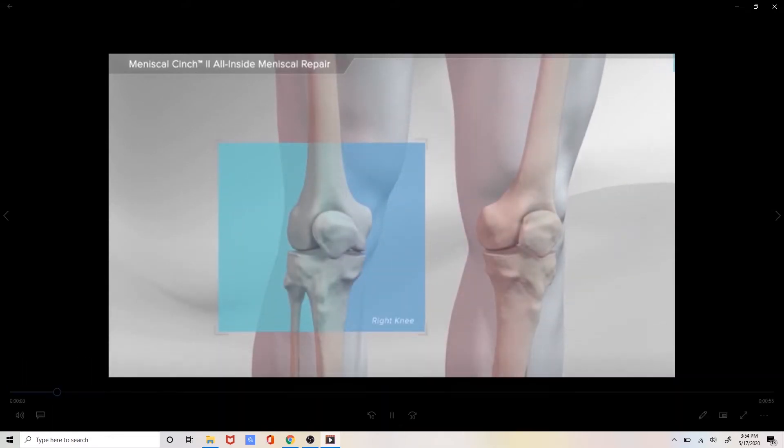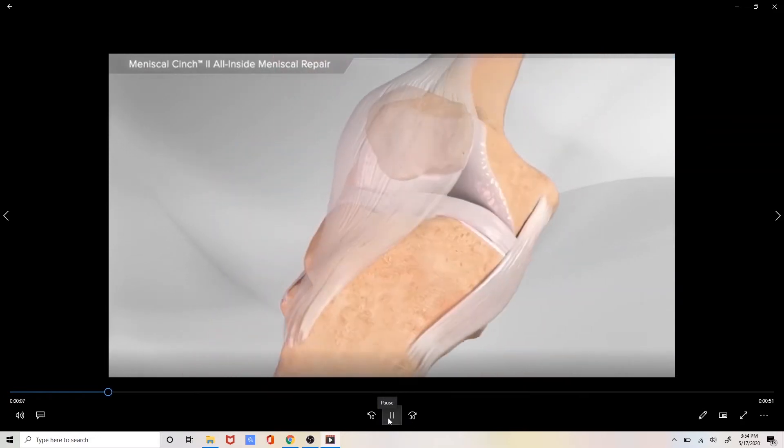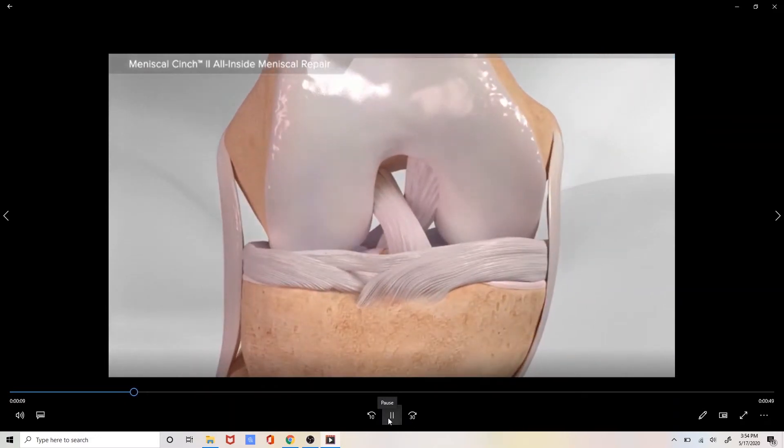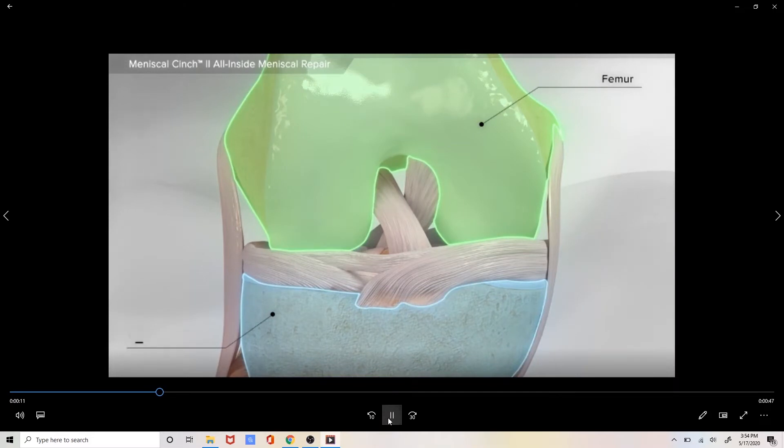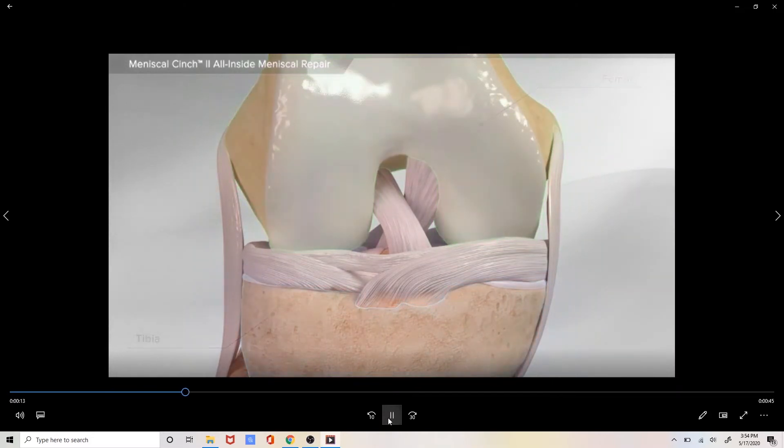Today's demonstration will be performed on the right knee. As we zoom in on the right knee we see the femur up above, the tibia down below.